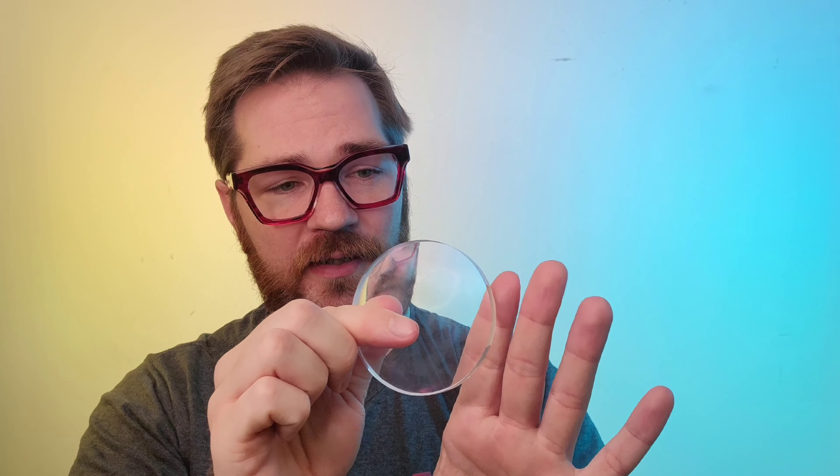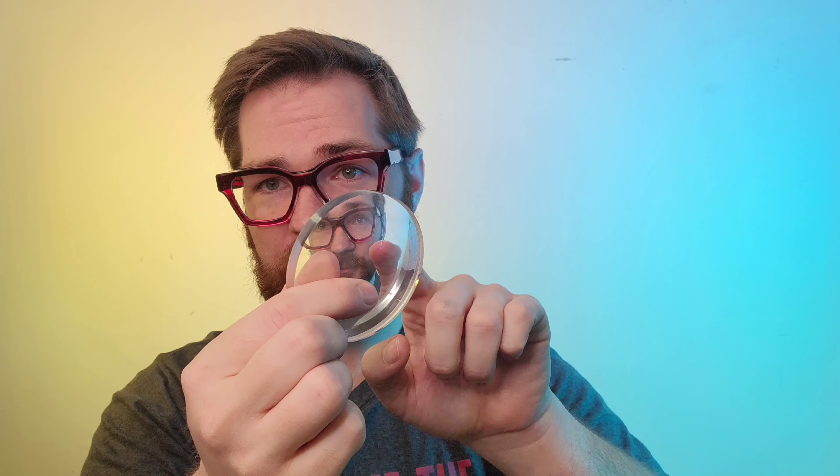I went a step further: this edge is frosted and finished, and this edge is polished. Both have that same lightly kissed safety bevel. Let me put it against my dark shirt so you can really see — there is not much of a difference in where that frosting starts. You can see right here we still have a frosted edge. And here is the polished edge with that really light bevel. The polished edge is actually worse because you're reflecting that safety bevel through the lens further.